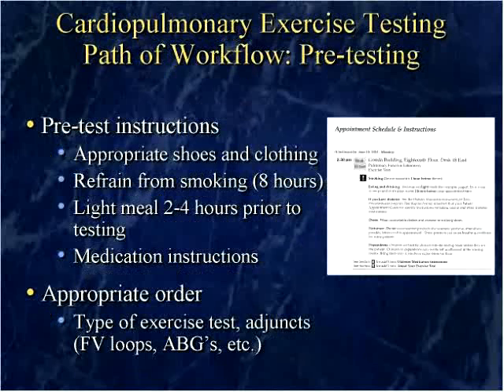So these patients should come in wearing appropriate shoes and clothing. We test young people all the time, and here they walk in for an exercise test with flip-flops on. And so you need to make sure that you've instructed them on the front end to wear appropriate shoes, wear appropriate clothing, refrain from smoking, eat a light meal a couple hours beforehand, but certainly not go out and have a Thanksgiving dinner before they come in and do your exercise test. Make sure that you have something in there about medication instructions, and all of that is presented to the patient so they arrive in the laboratory ready for this test, and they'll be able to give you their best effort.